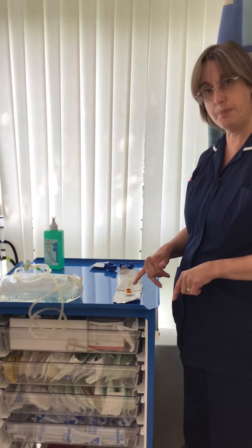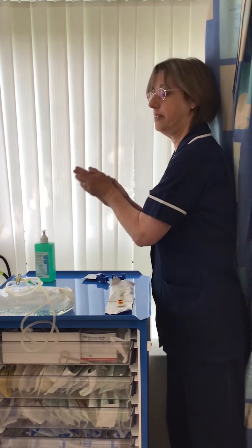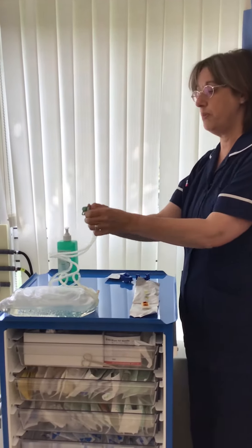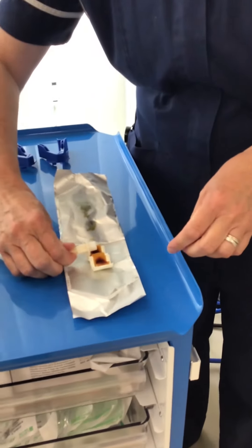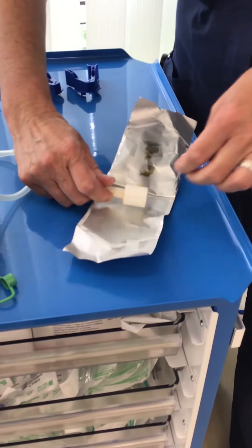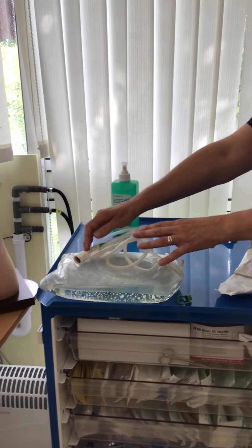Do not touch the brown sponge part. After opening your shield, alcohol your hands. Next, pick up your bag lines and remove the coloured tag, keeping hold of the exposed lines, and then apply your shield. Once the shield is on, replace the lines onto the bag.